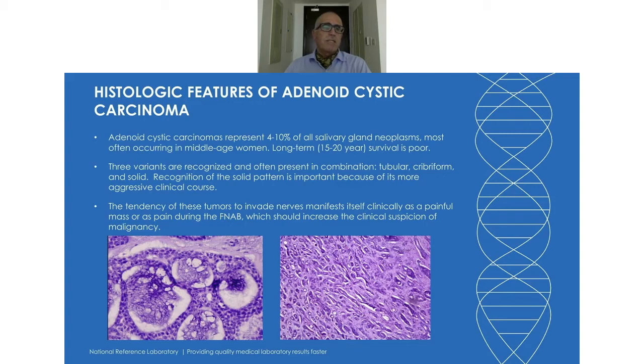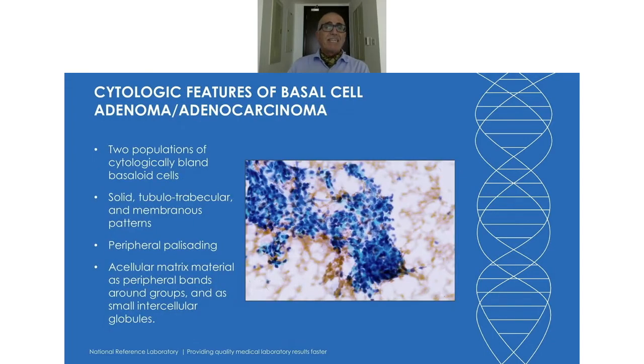That is, gland-like spaces with matrix surrounding these aggregates of basaloid cells, but in the background you also see the more typical myoepithelial type of cells dispersed in the stroma. So these are the sort of lesions which raise for sure the possibility of this being a malignant lesion.